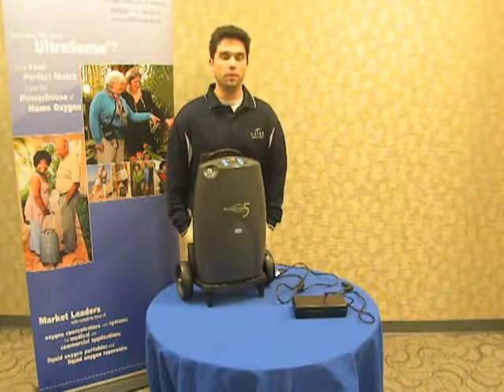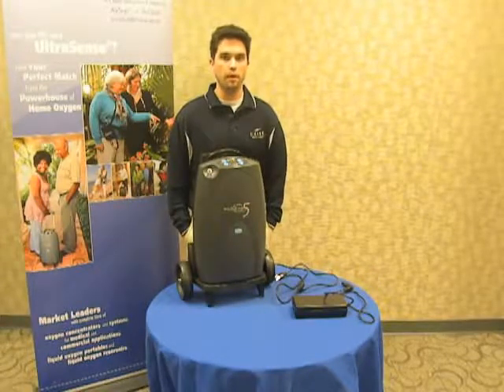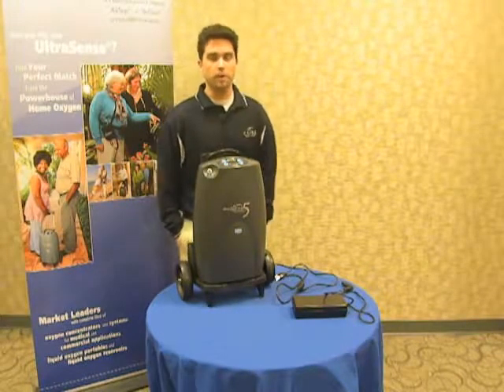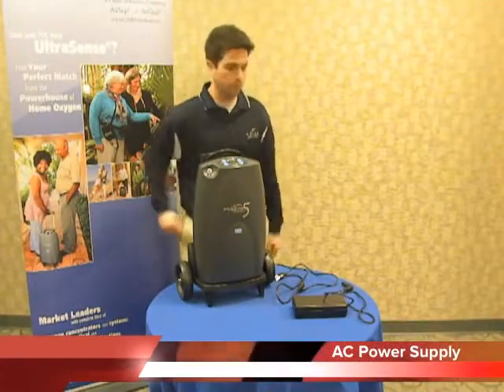Remember that your battery only comes shipped to you at 40% charge, so you will need to charge the battery fully before you begin to use the SeQual Eclipse for portability. In order to charge the battery, the best way to do that is to connect it to the AC power supply, which we'll talk about now.